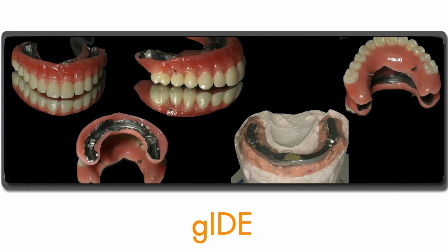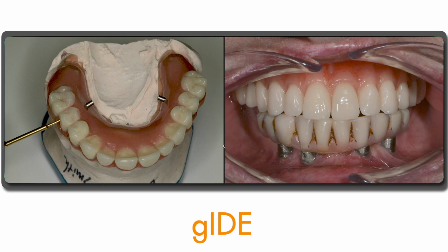And this solution here, you can probably see quite clearly in the images, there's the prosthesis fitting onto the bar, and it has the lingual pins, or in this case it's palatal pins. But when we want to lock it in, the patient squeezes on the palatal and pushes these pins into place. So as it locks into the milled bar, it also fits a snug fit on the anterior portion of the bar as well. So there's some mechanical friction provided by the bar, as well as the lingual sort of cross-pinning that's occurring from these metal pins. So you can see when the patient wants to pop them out, they can use a paper clip or this little key, they pop them out.